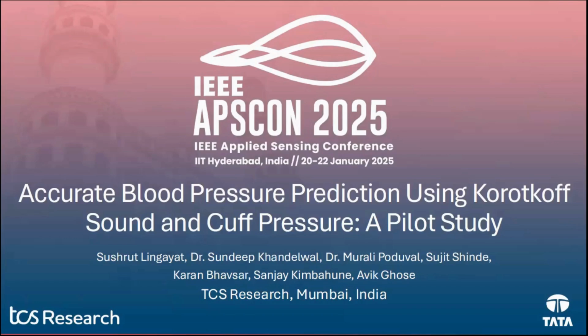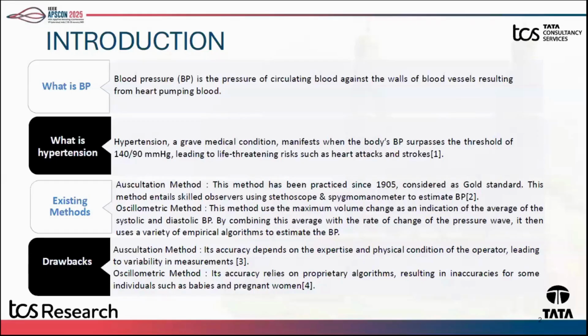Today I'm presenting my work on accurate blood pressure prediction using Korotkoff sound and cuff pressure. So this is a pilot study. I'll first introduce some terminologies and then I'll move on to the work. So first, what is blood pressure?